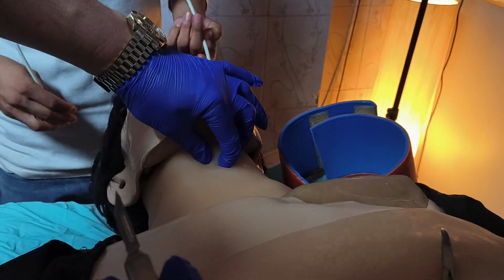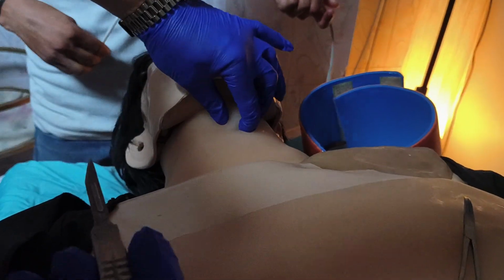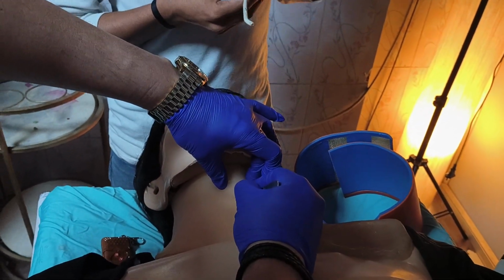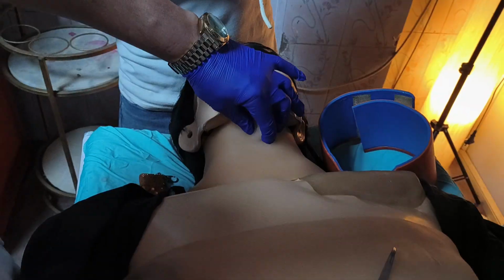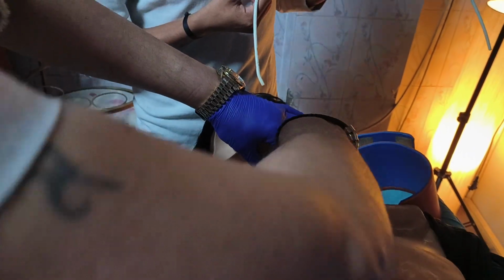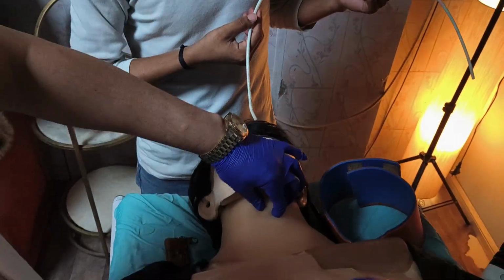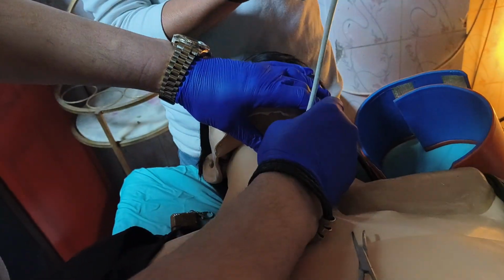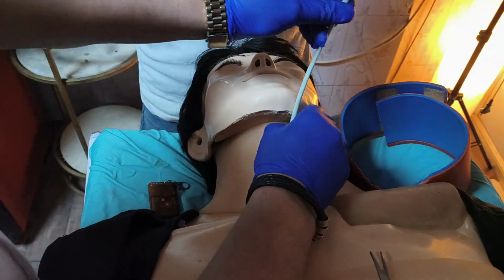So now I am doing surgical cricothyroidotomy. Okay. So three finger technique in the midline, approximately 1 inch. Okay. You can use a cannula also, or you can use a finger to dilate. So I am inserting the bougie, then the tube.